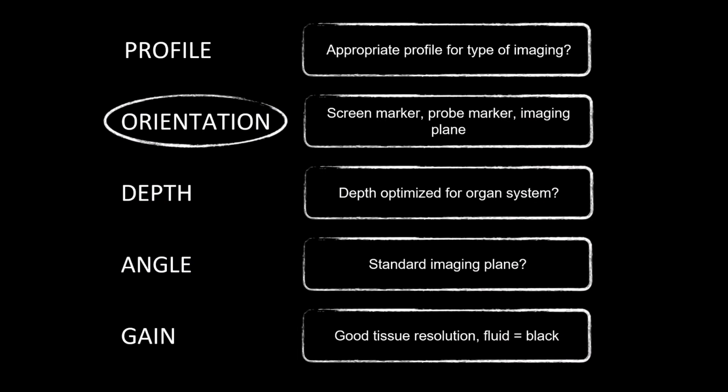You have to start by recognizing the different elements on your screen. These include the obvious and important depth measurements, but include as well the orientation marker and the focus point. The orientation marker is a critical point to be aware of.